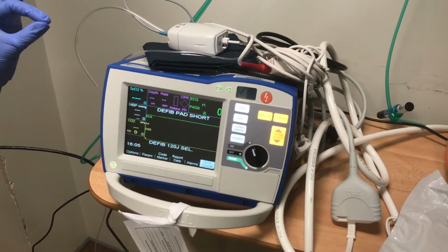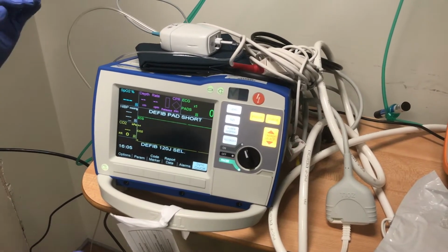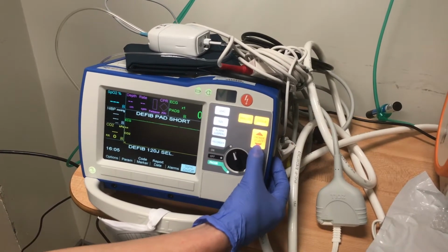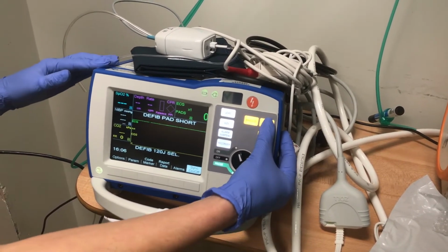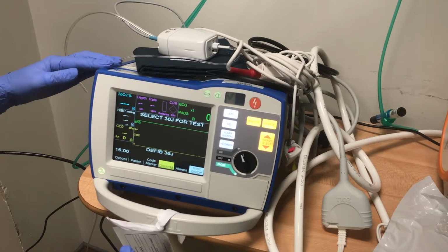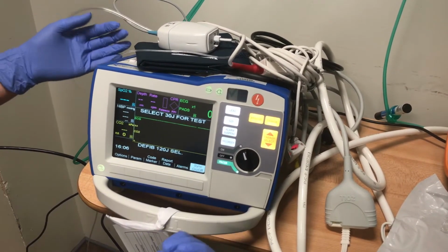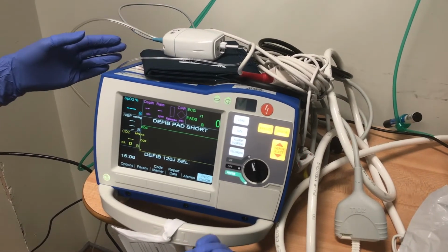If you don't want to deliver the shock, the only way that you can dump that charge is basically press energy select down or up. So for example, if I press charge, oh, it does say disarm there. And there's another way to do it.